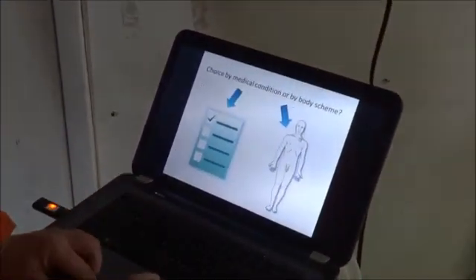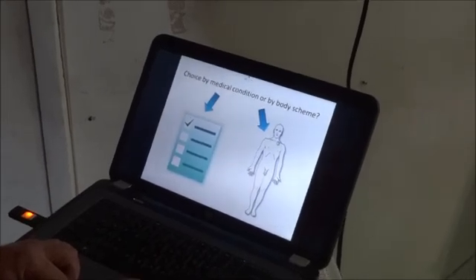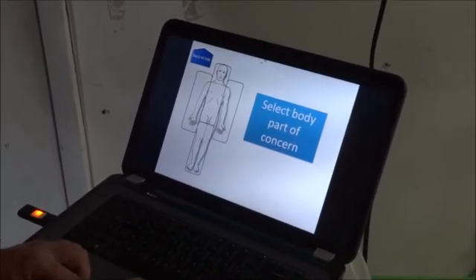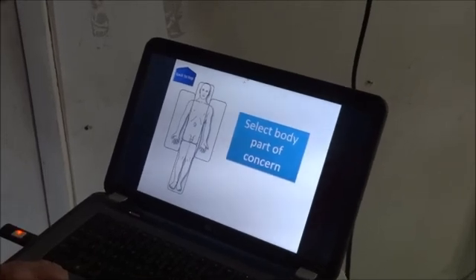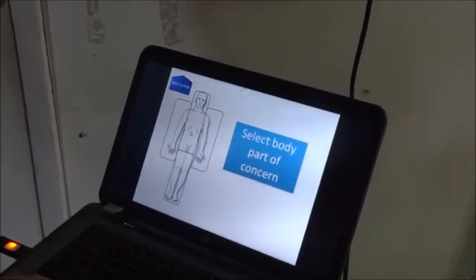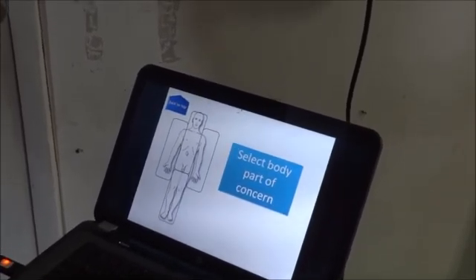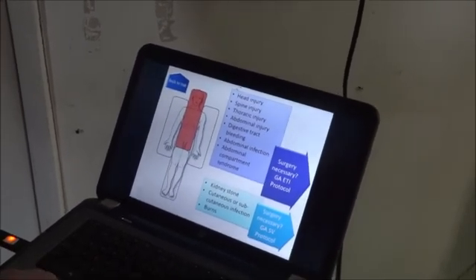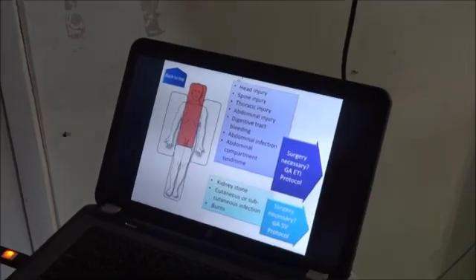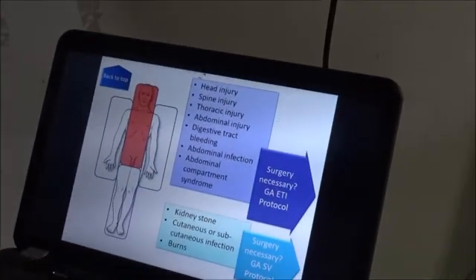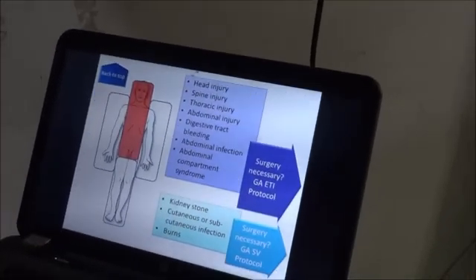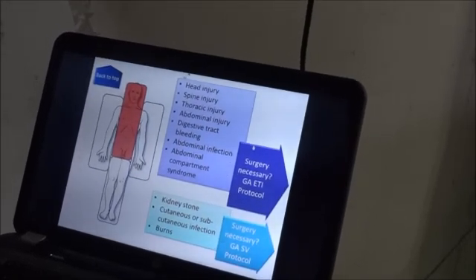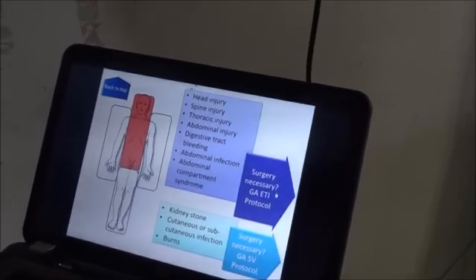The first step is to decide which is the best general anesthesia for this scenario. He knows that the injured part is the abdominal, so he's just clicking on the abdominal region, and then, because it's a situation of abdominal injury, he is clicking on GA with ETI, which is endotracheal intubation.